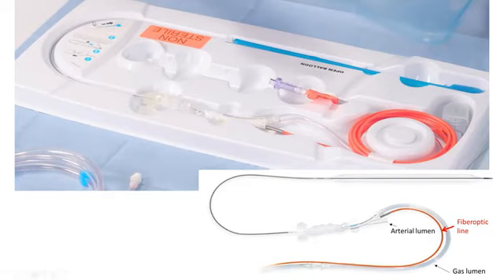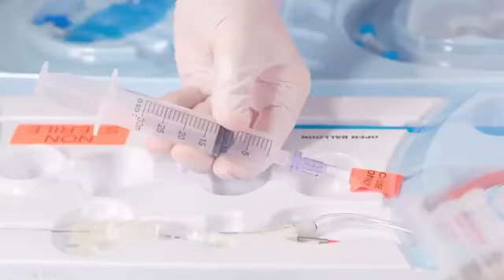What we do here on this tray, you flush that arterial lumen here, and you put negative suction on the helium lumen here. This gas lumen, you connect it to this valve, and you put negative suction with a 30 milliliter syringe, and you disconnect the syringe here while holding negative pressure. That valve will hold the negative suction on the balloon. This will allow you to advance the balloon more easily. Okay, so you do that negative suction.